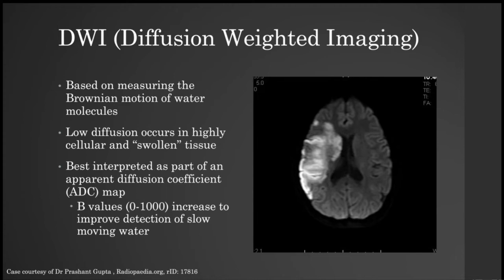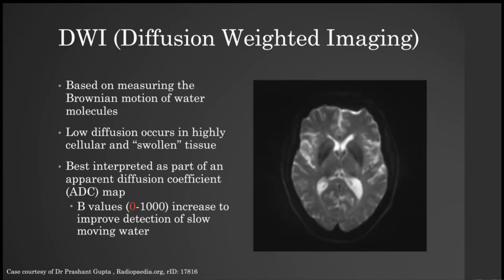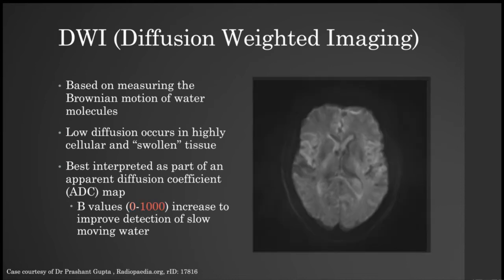And then you see these, if you look on your sequences. A lot of times we're jumping to a DWI, and all the residents are looking through the sequences. These are these B value sequences. So this is a B0, and you'll see a B1000, and a B1000 is probably a little bit closer to the DWIs that we look for. So if you're looking through sequences from other places, a B1000 is close to a DWI, but you want to make sure that you correlate that with your ADC.